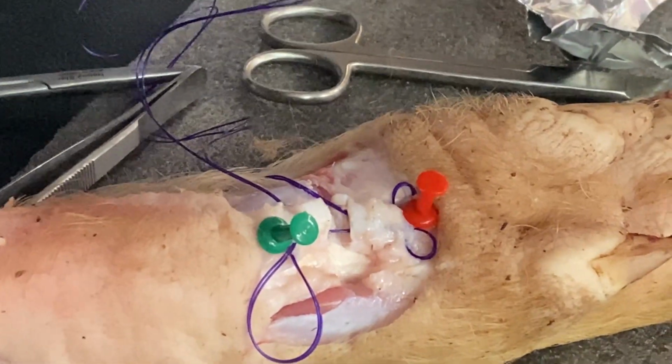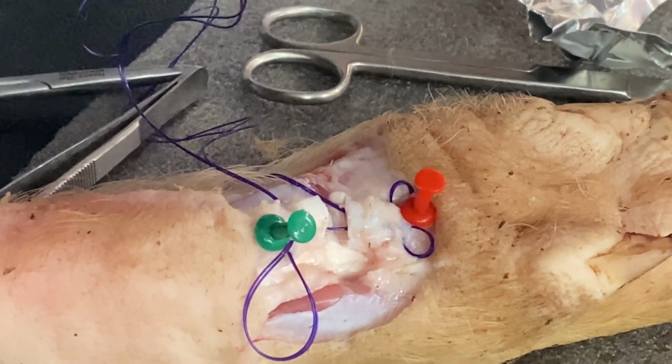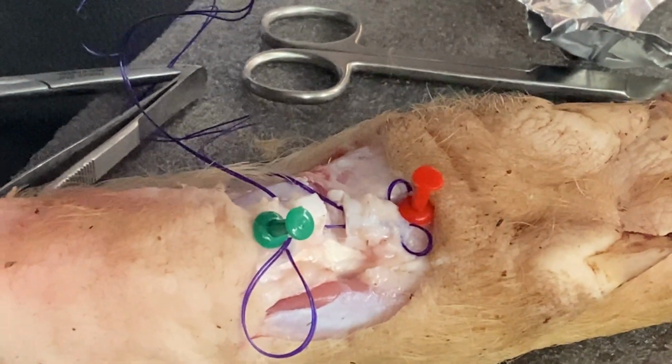The way you are holding the forceps is not correct. It should be held like a pencil. Sorry.